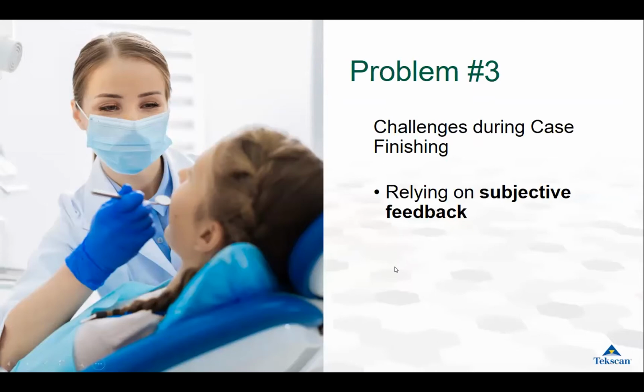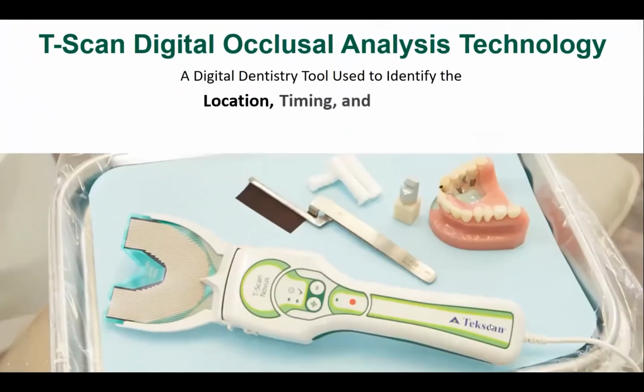Which brings us to T-Scan digital occlusal analysis technology. T-Scan is a tool that has been proven to address these main problems and more. T-Scan gives you measurable data that identifies the location, the timing, and the force of your patient's bite, data that does not exist anywhere else.